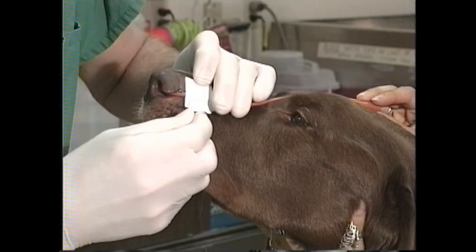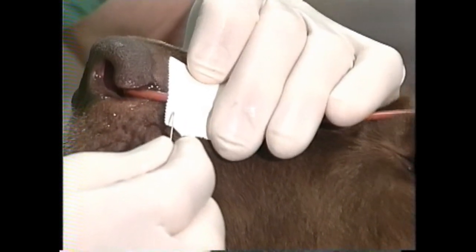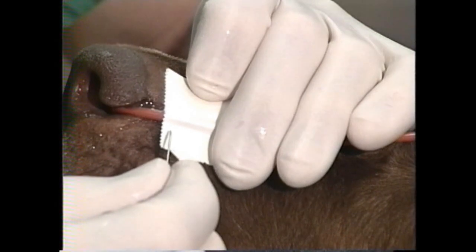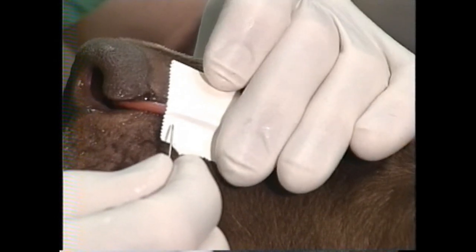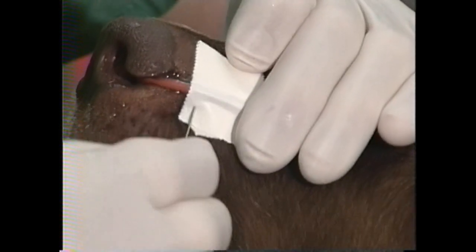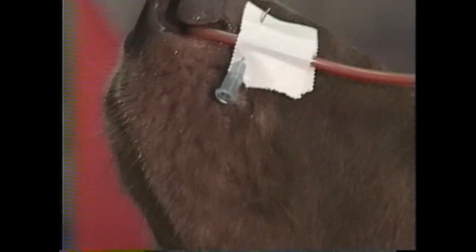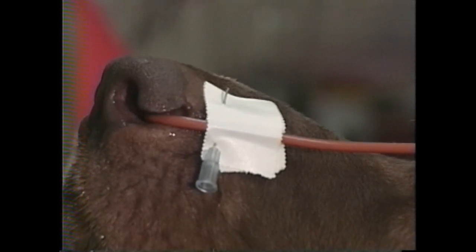Now I'm going to place this 22 gauge needle through the leading edge of the tape at the junction of haired and hairless skin at the nasal planum. You don't want to go through the hairless part because that's pretty sensitive, but be as close to that as possible. I'll drive the needle through the tape, then grab some skin, and then out the other wing of tape on the other side, and confirm that I've grabbed some skin by lifting up on the needle. I find that the 22 gauge needle is tolerated by dogs much better than a swaged-on needle, so I prefer to use this.